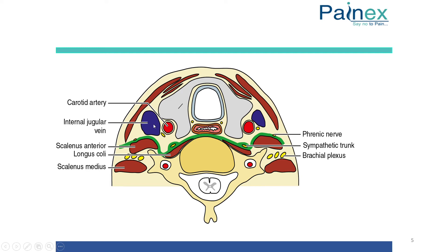Now, what are the soft tissues around the stellate ganglion? We start from the midline and go laterally. This is the trachea, then the thyroid, and we can see the carotid artery, internal jugular vein, and vagus nerve. This is the vertebral body, and we can see a muscle lying above it — the anterolateral aspect is the longus colli muscle. Within the pre-vertebral fascia we can see the sympathetic trunk. Other important structures are the brachial plexus a little more laterally.